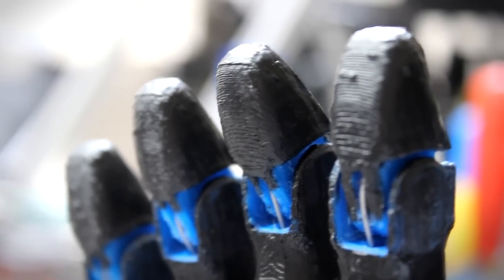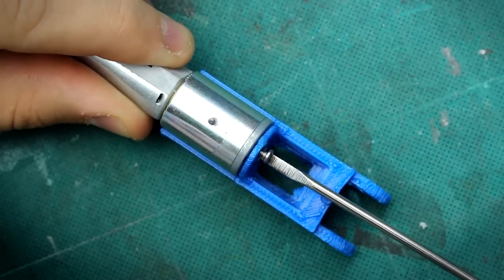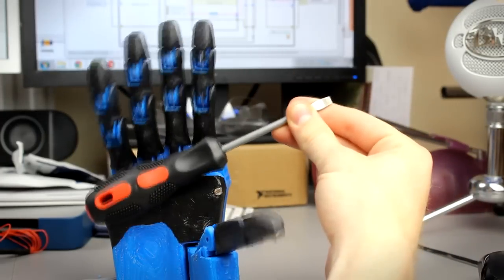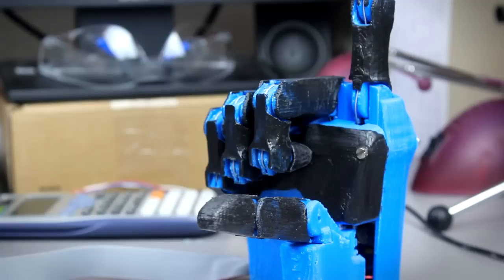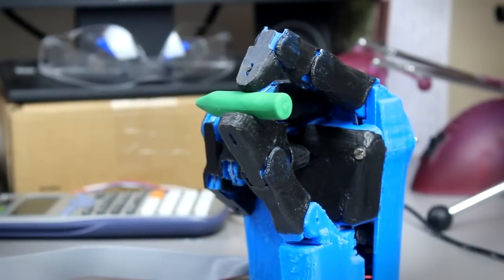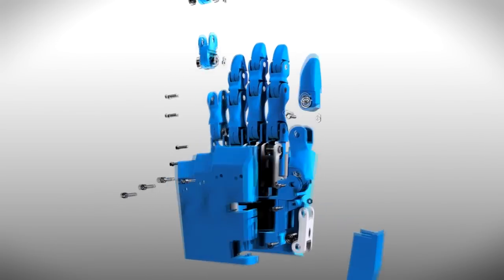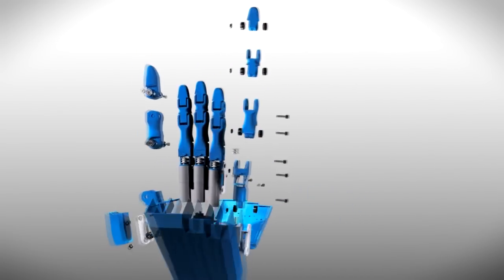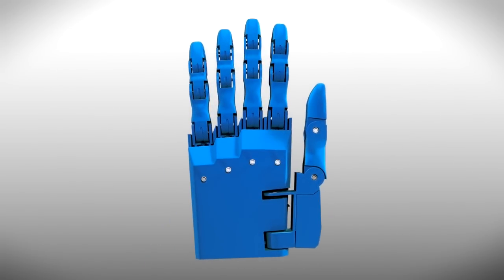Each finger is individually actuated by a high efficiency DC motor. It uses feedback to work out when it can feel an object in its grip. This means that it can grasp delicate objects without breaking them, but can still unlock the force to grasp heavier items when needed. The fingers use tendons, just like a human hand, which gives the Dextrous a natural gripping ability that can be used to handle objects of all different shapes and sizes.